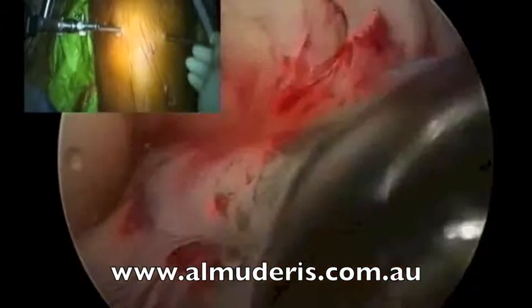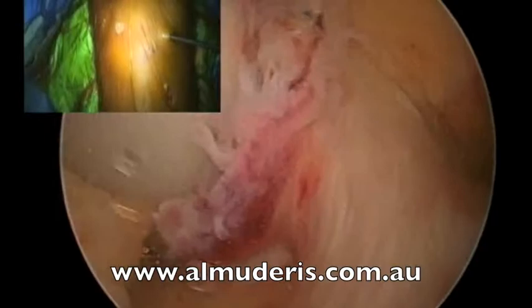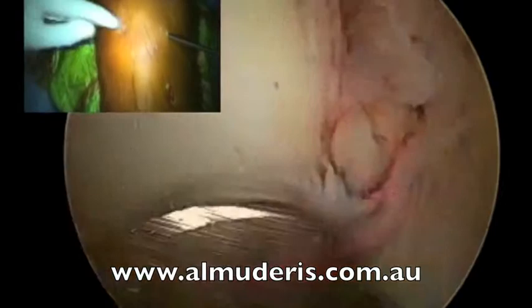As you can see, it is very clear that the ACL is ruptured, and it is an acute rupture. Then we swap the position of the scope and ask for x-ray to come in. I use an image intensifier in my ACL reconstruction, especially since it is readily available in the hospitals I work at, and it is much safer to perform it under image intensifier guidance.